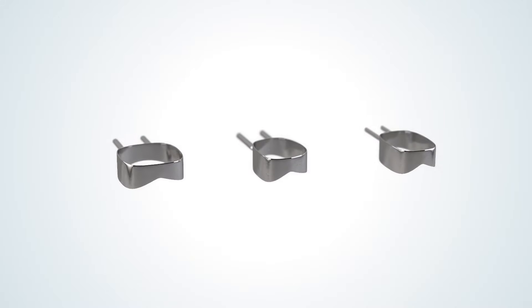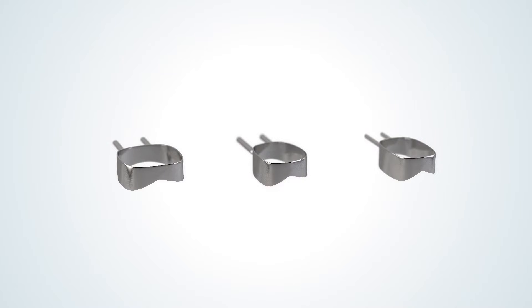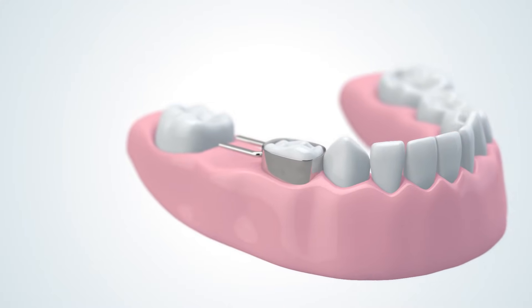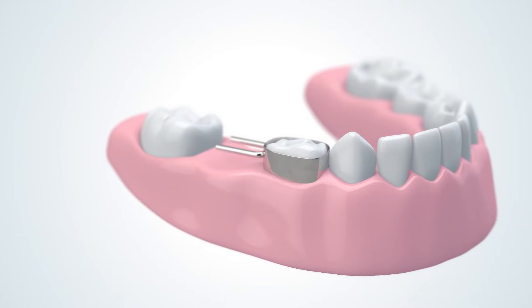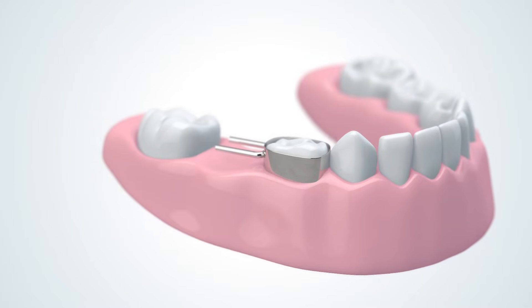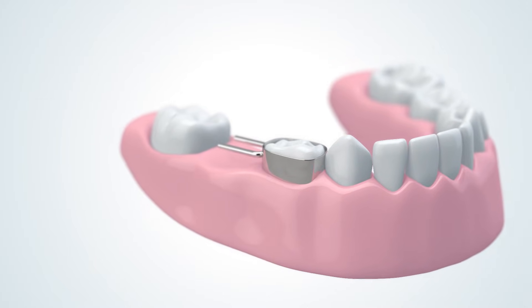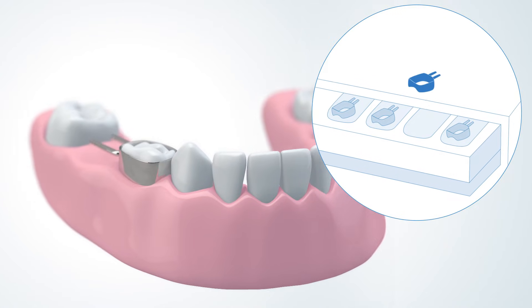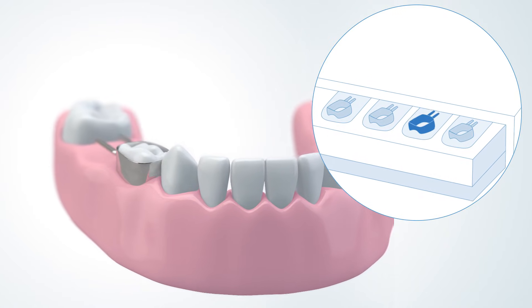Start by selecting one to three approximate band or crown sizes from the DeNovo Space Maintainer Kit, and then trial fit them to the tooth neighboring the space. A properly fitted band will slide onto the tooth with a tight, snug fit. The stronger the fit, the more durable the device will be. Bands or crowns that are tried but not used should be sterilized and then placed back into the kit for future use.